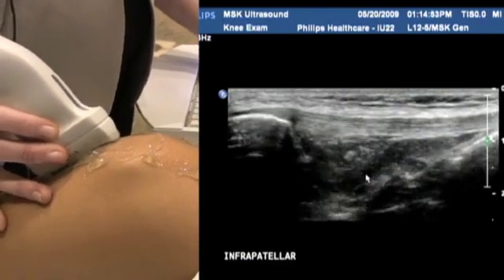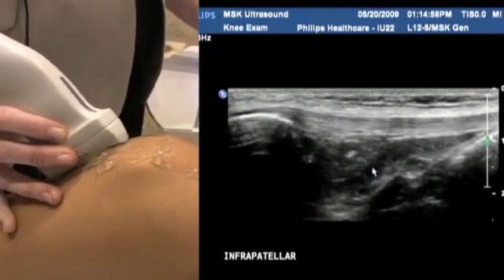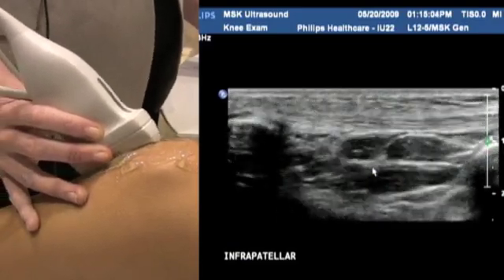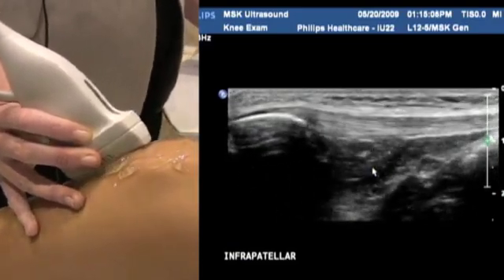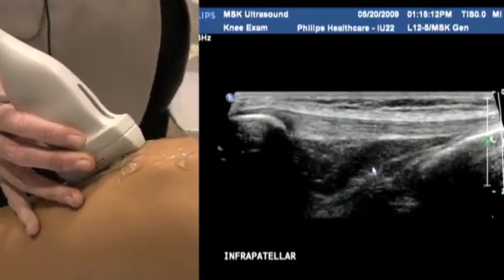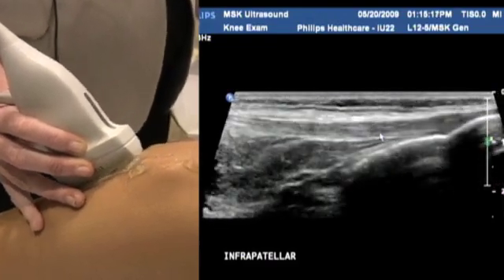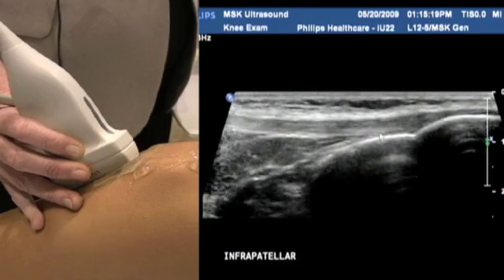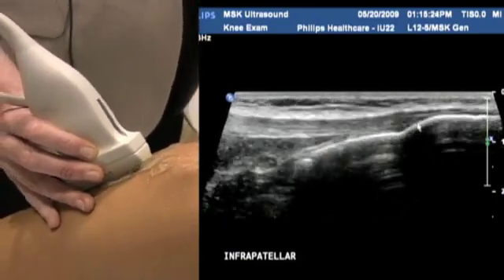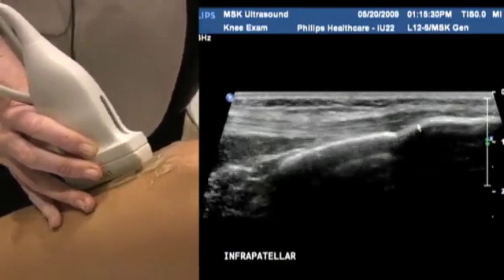Below, there's a thing called fat pad. Again, quite normal for it to be hypoechoic soft tissue down here. And again, just sweep side to side, make sure you're covering the entire tendon from medial to lateral. Again, with the 12 megahertz transducer, we can almost get the entire length of the tendon. It's quite a long tendon, and its distal attachment here. You can see it fans out as it attaches distally. So again, really important to make sure you scan medially to laterally and make sure you cover that entire distal attachment portion.